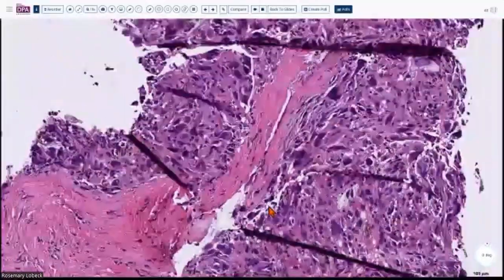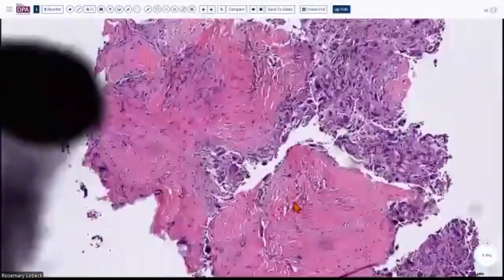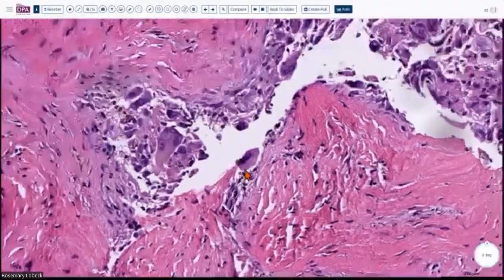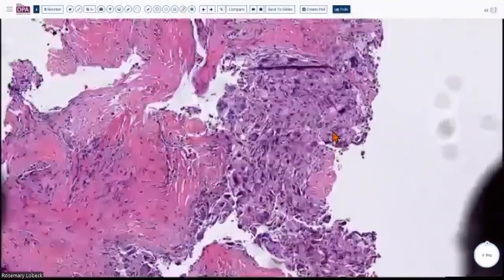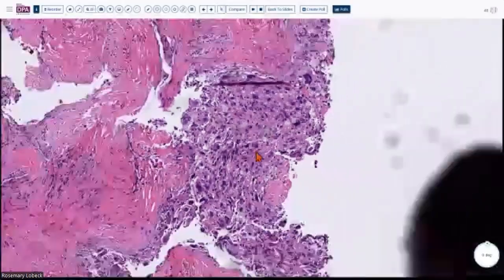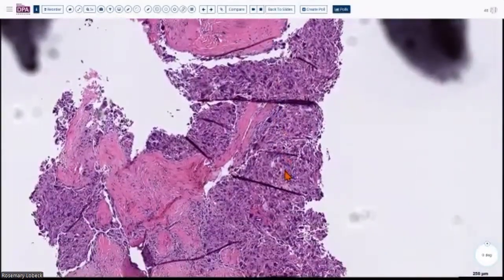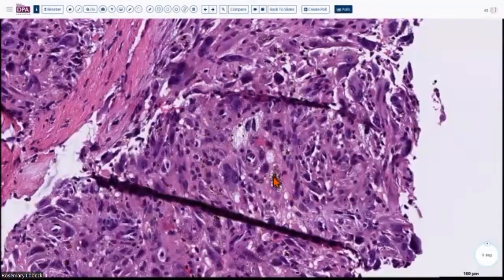I think my colleague also marked mitosis somewhere over here, so perhaps this one is even an atypical looking mitosis, right? But then we also noticed some other things. So the cytoplasm is very foamy, almost histiocytoid cytoplasm. And in addition to that, the cells reveal their histiocytic nature by the fact that they do have this hemosiderin pigment inside the cytoplasm, almost like lysosomal digestion of hemosiderin pigment.